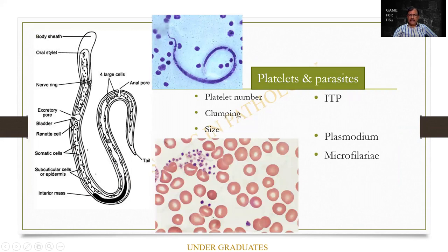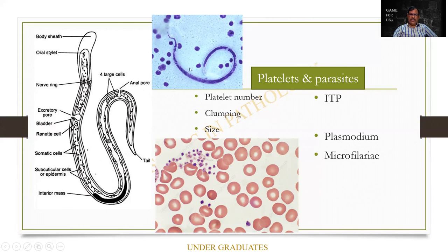Platelets: one to two microns, seen in clusters, somewhat pinkish gray in color. Parasites: this is Wuchereria bancrofti, more important in microbiology. It has a blunt head, a sheath, a sharp tail, and the tail end is free of nuclei. All the dark dots are called the nuclei. This can be kept as a spotter in the examination. The importance of platelets relates to ITP, which can be kept as a chart. Plasmodium malaria — vivax or falciparum — can be focused. Microfilaria is again a slide for students.